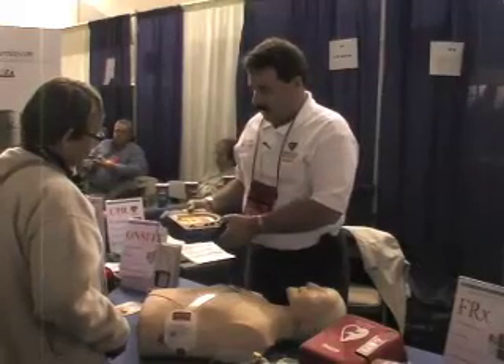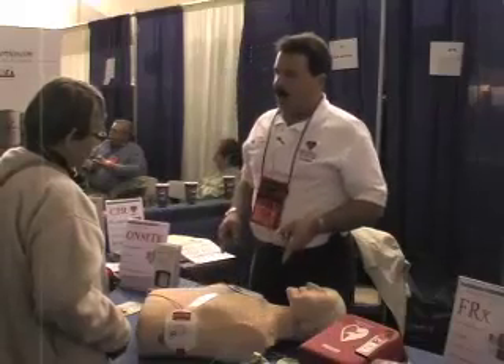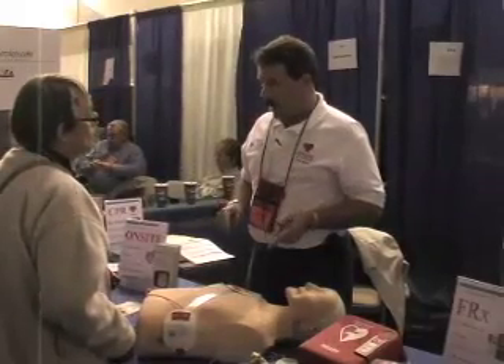And then it reanalyzes for a couple of seconds. After giving one shock, it will then tell you to begin CPR. It'll actually coach you through CPR if you wanted to.